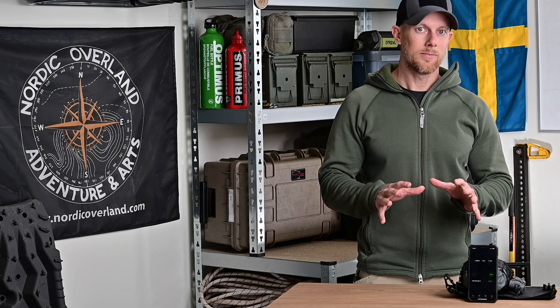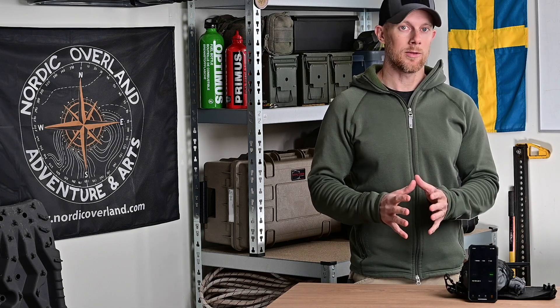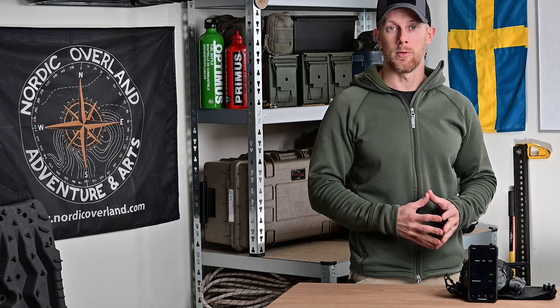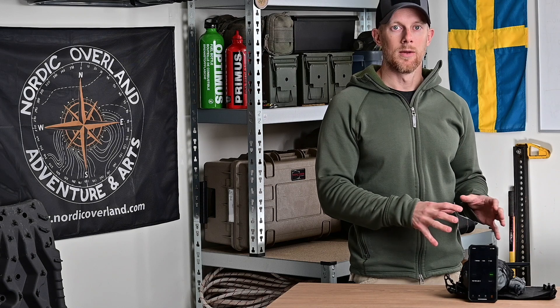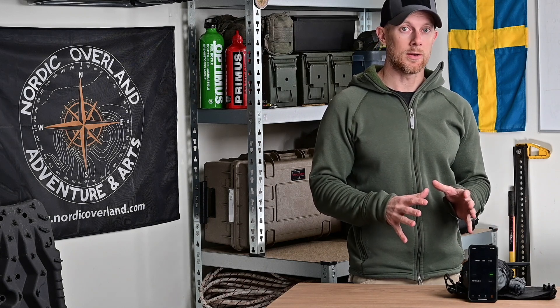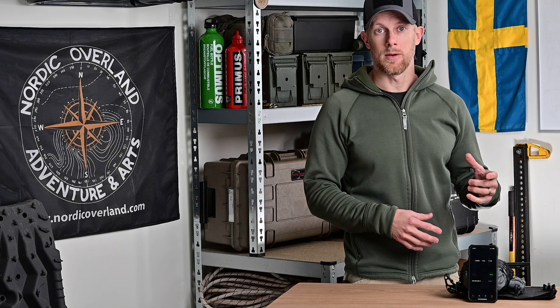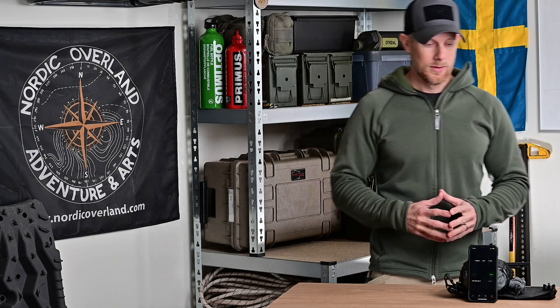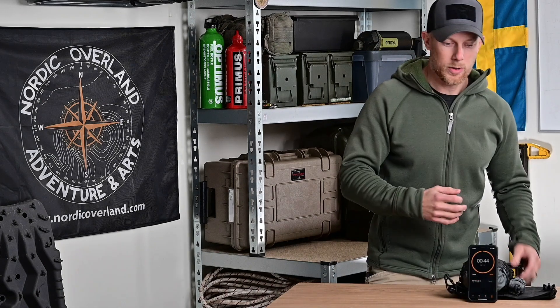Kopplat till att öva med tonikén: använd alltid en dedikerad övningstoniké. Använd absolut inte din skarpa toniké som du har med dig ut som sjukvårdsberedskap – ha en separat toniké att öva med. Den skarpa tonikén är att anse som en engångsartikel och förbrukas efter användning. En övningstoniké kan användas flera gånger, men ta absolut inte med den skarpt. Nu startar vi tiden och kör.